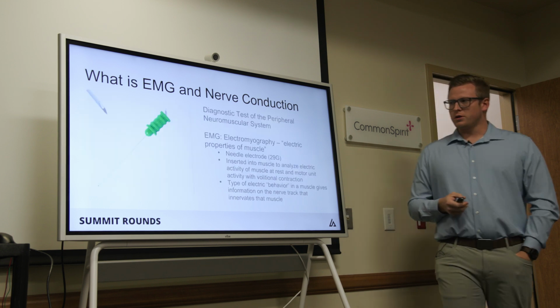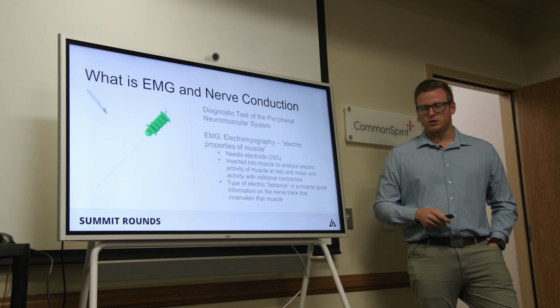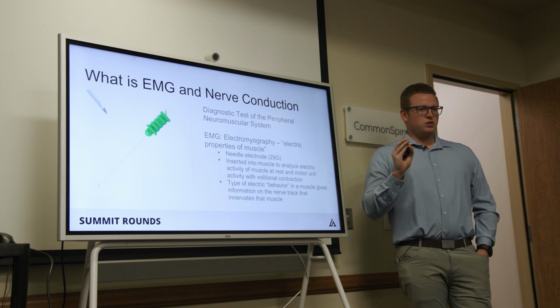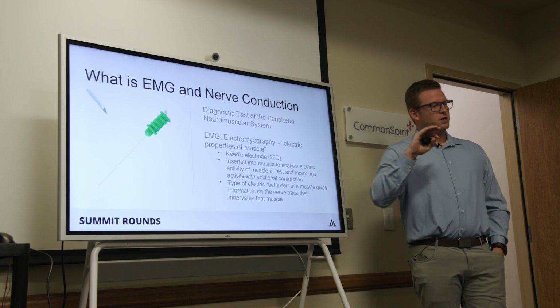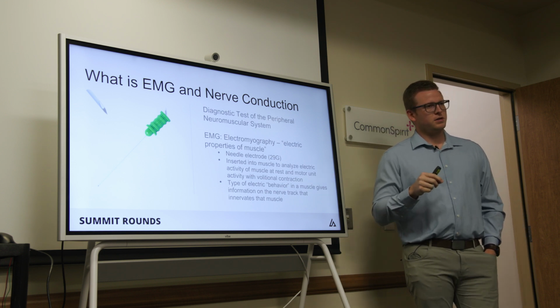And then the second part is EMG, electromyography. So if you break that word down, electric properties of the muscle. Basically, a needle electrode is inserted into a muscle and records the electric activity in that muscle and converts that into sound and waveforms, which you'll see here in a minute.